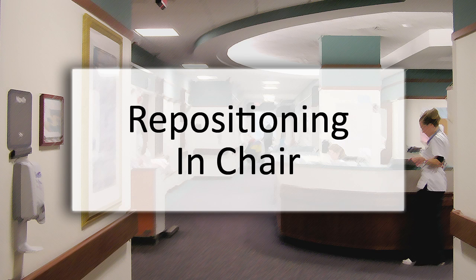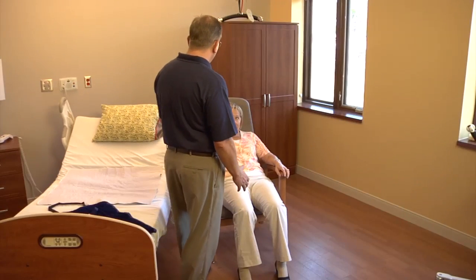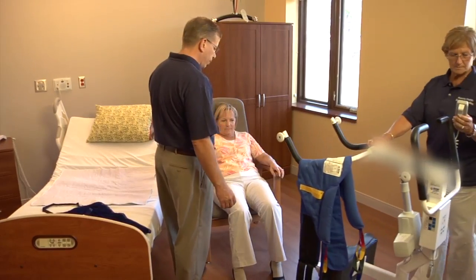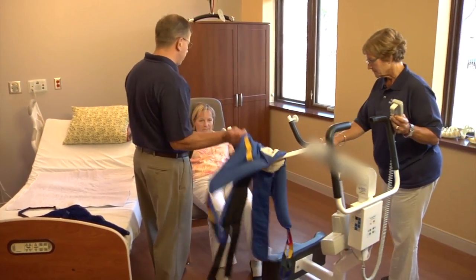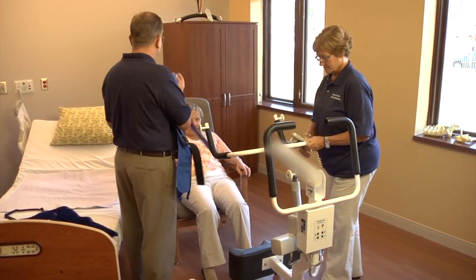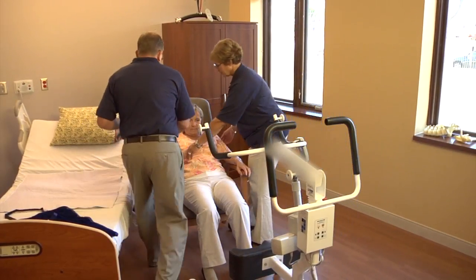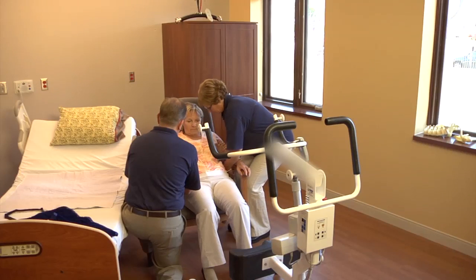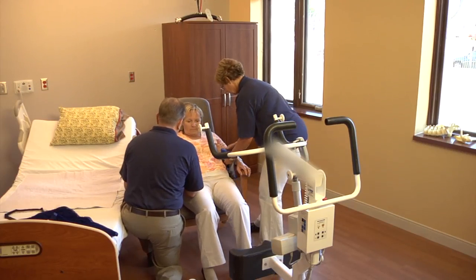A task that is loaded with risk is repositioning. It can take up to 2 and 4 people to reposition somebody manually. In a safe patient handling environment, we assess on the best way to reposition a patient by using the tools and the strategies that are in a comprehensive safe patient handling program. A sliding patient can pose a lot of risk to the patient and to the caregiver.